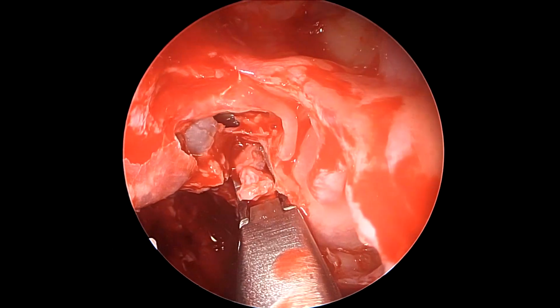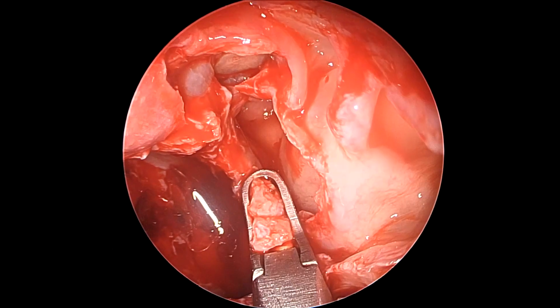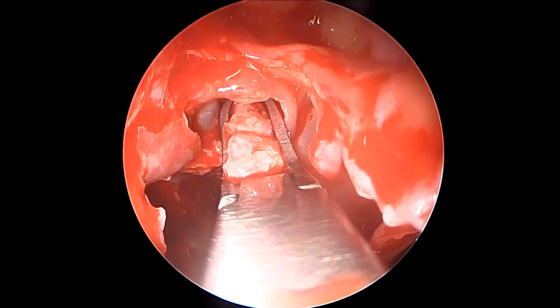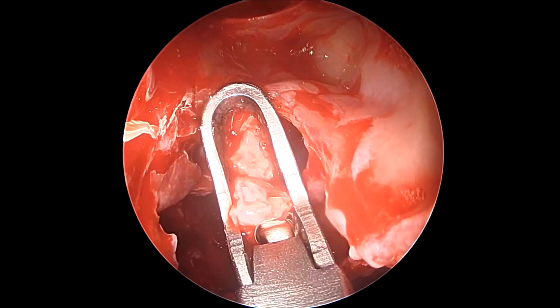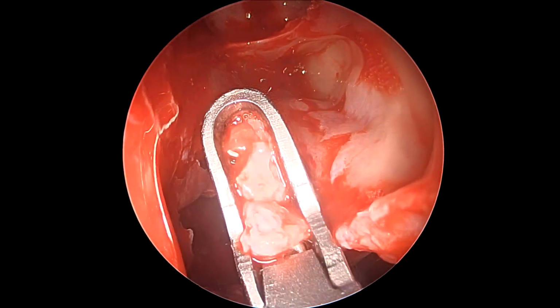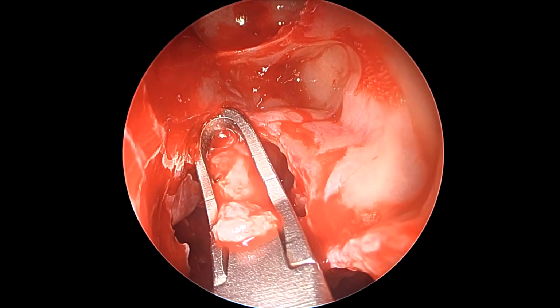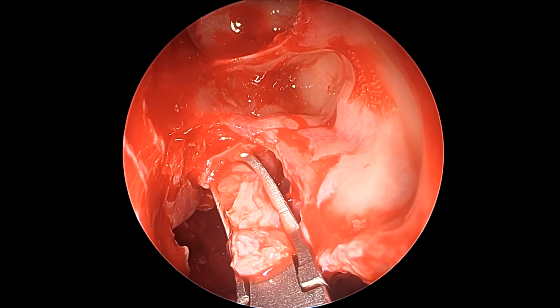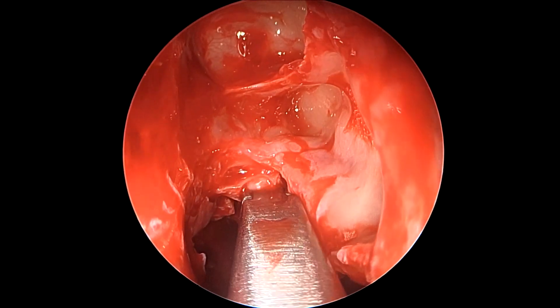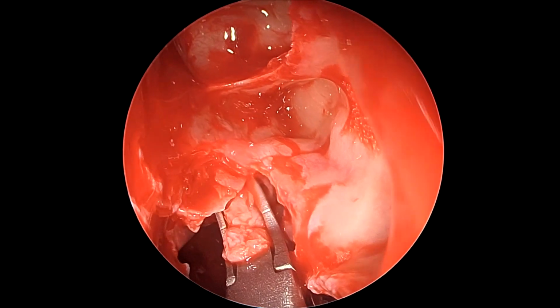And we can see how, unlike what we thought before, there is a considerable amount of bone which can still be removed to complete our ethmoidectomy widely. Now, since we are palpating, we still know that there is more bone that can be removed. And again, we can bite in small increments to increase our access so that our ethmoidal cavity becomes essentially like one cavity with minimal or no septations to occlude our vision.